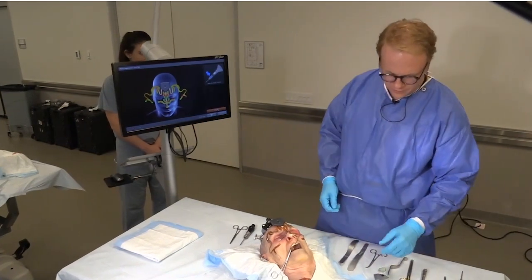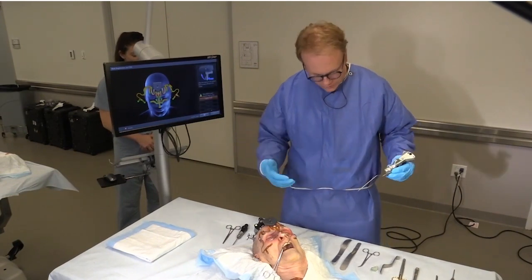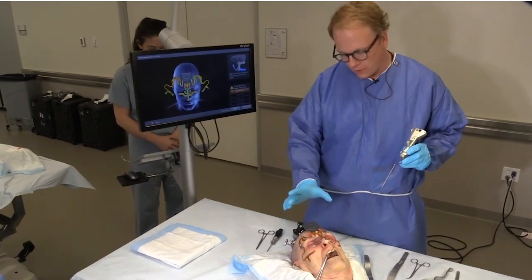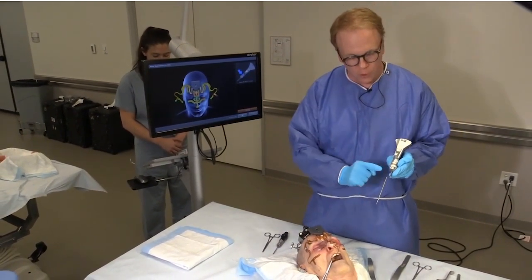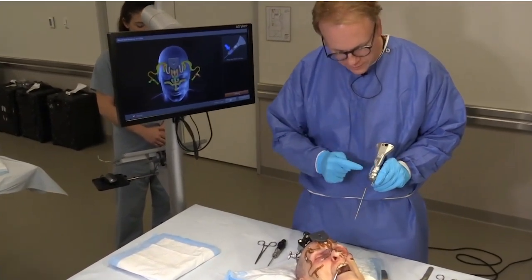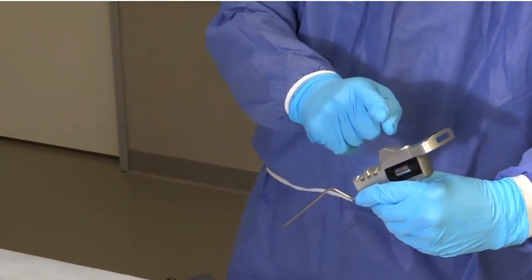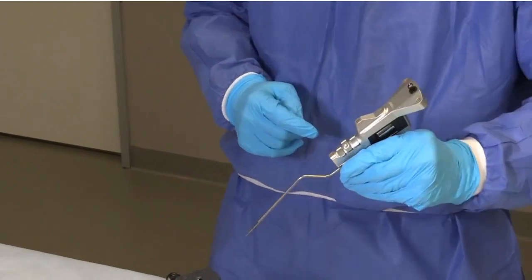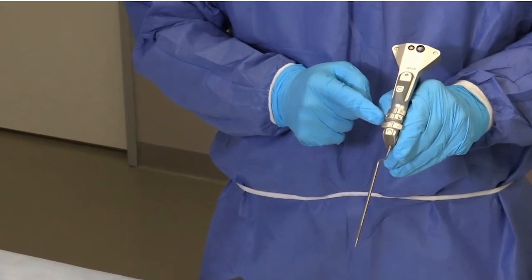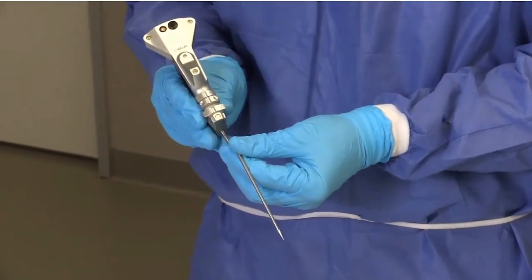The first thing navigation is useful for in orbital deformities and reconstructions is helping with your dissection. Once you've got your registration and your mask on, you're ready to use the probe — which acts a lot like the mouse on your computer. If you look closely, there's a light system that needs to face the eye and communicate with it. There are rows of buttons on the left side and right side, which perform identically, allowing use by either a left- or right-handed person.